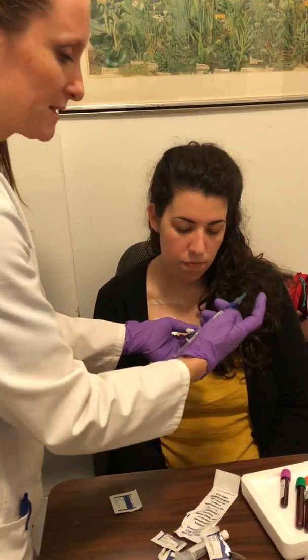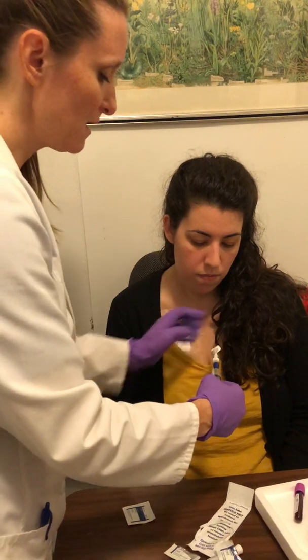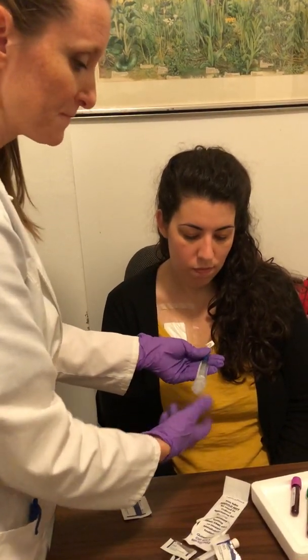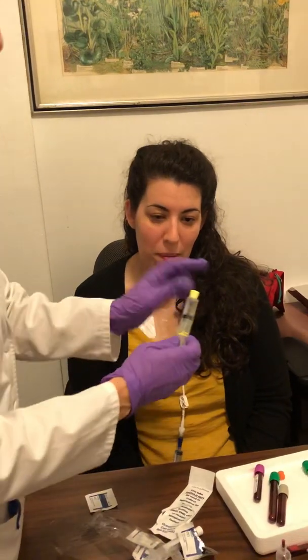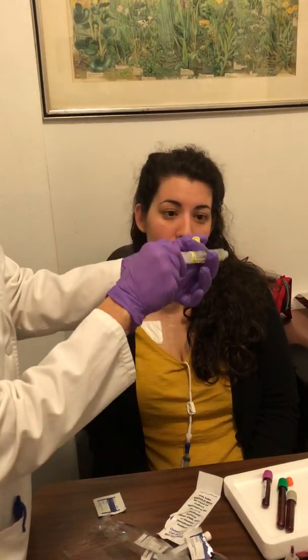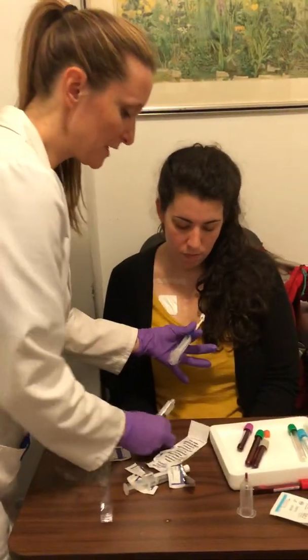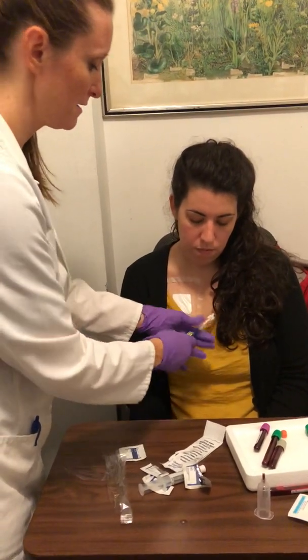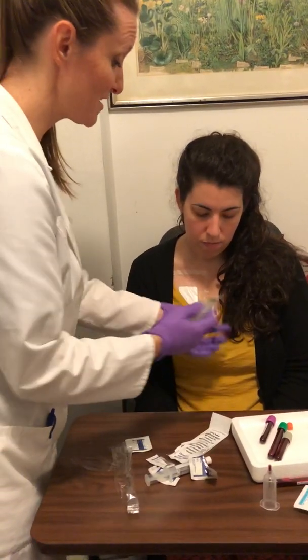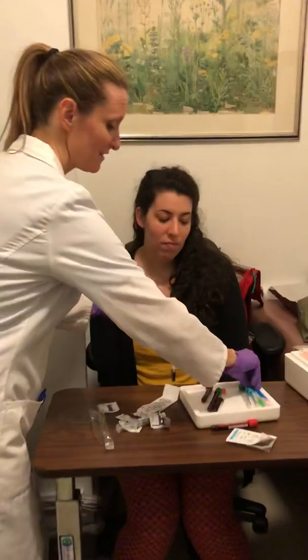Remove your blue cap, take off the protective cap, attach that, unclamp, and continue to flush with your saline. Then prepare a heparin and heparinize the line. Remove the bubble that comes with the heparin by pulling back and then slowly going forward until you get a little bubble — always hold on to the blue. Disconnect your flush, heparinize your line, clamp, and we're done. That's how to draw from a Hickman or a PICC line using either a butterfly or a needleless system.